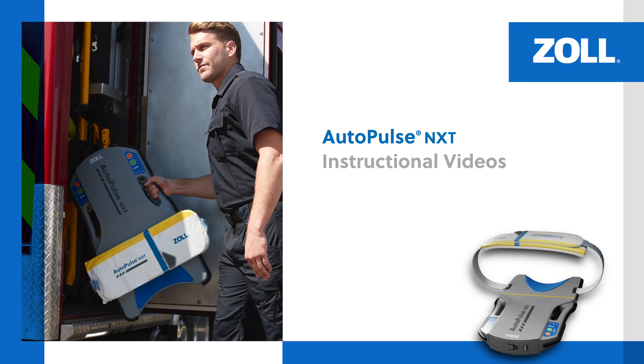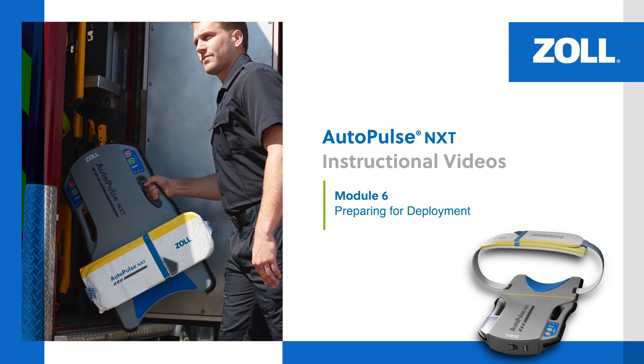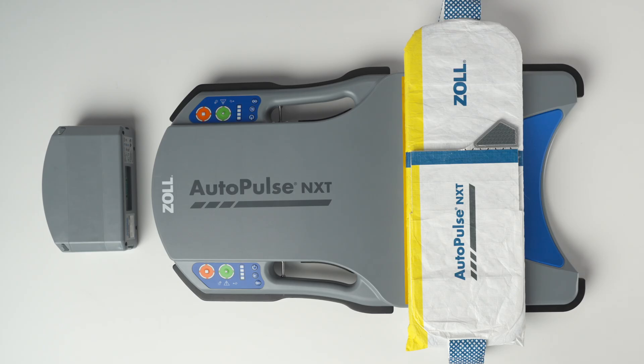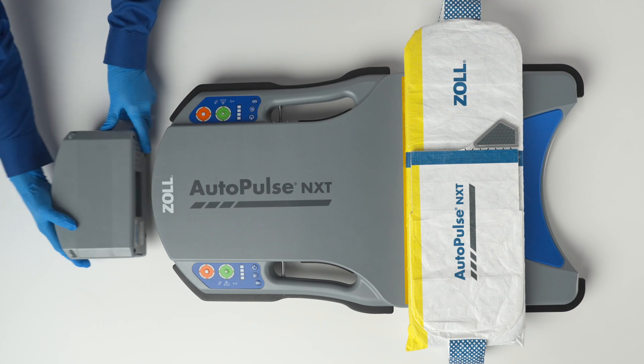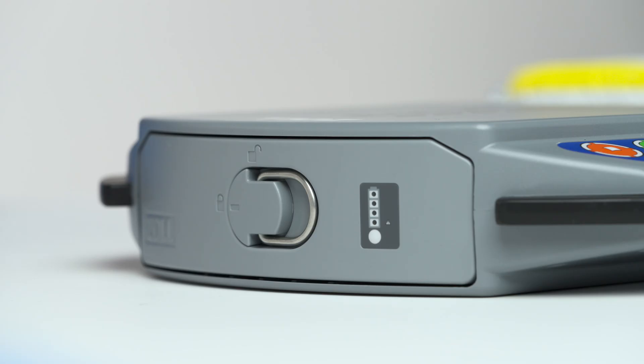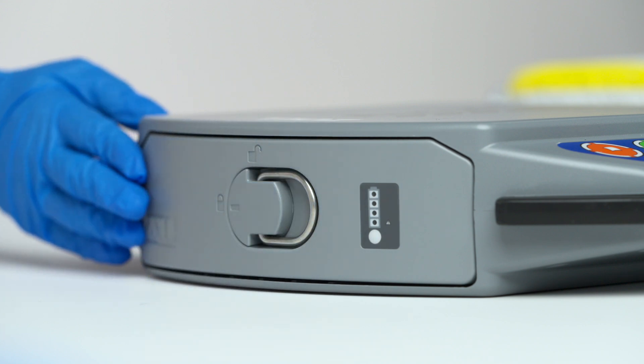In this module, we review how to prepare the AutoPulse NXT Resuscitation System for deployment. To prepare the AutoPulse NXT System for use, install a fully charged battery by sliding it into the battery compartment at the top of the platform, ensuring the battery is flush with the platform.